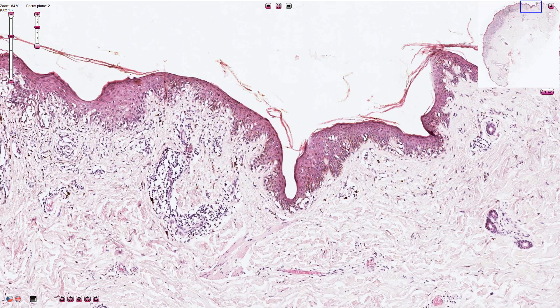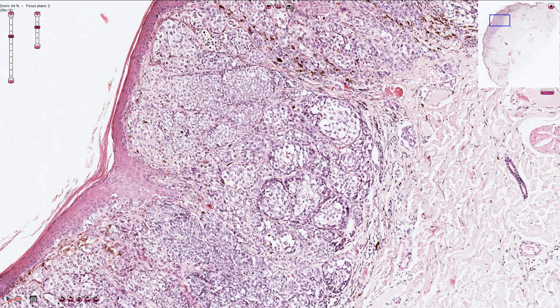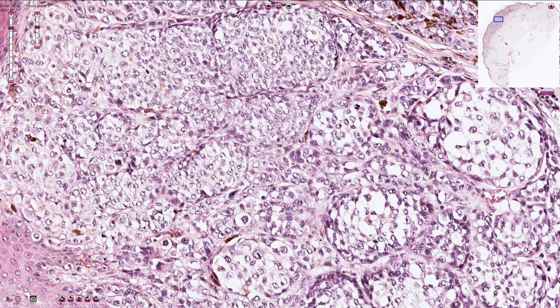Some melanocytes are also localized in the upper portion of the epidermis — so-called pagetoid spread. Looking at the center of the lesion, the intradermal component is not associated with maturation of the melanocytes. The melanocytes in the deeper parts of the dermis are still quite atypical and large. On higher magnification, we can find quite a lot of mitotic figures, and some of the melanocytes have really atypical, ugly-looking nuclei.